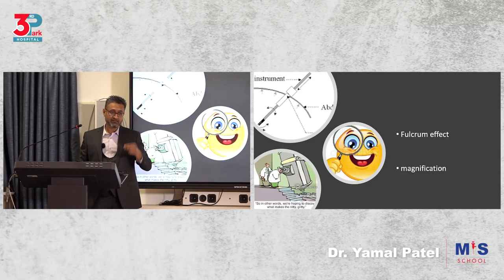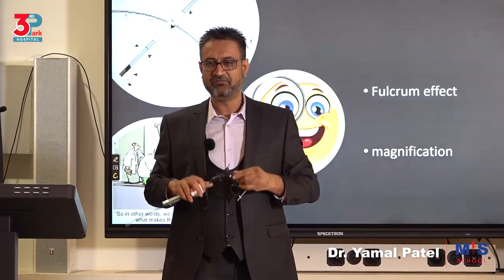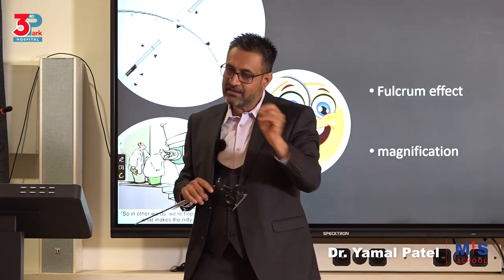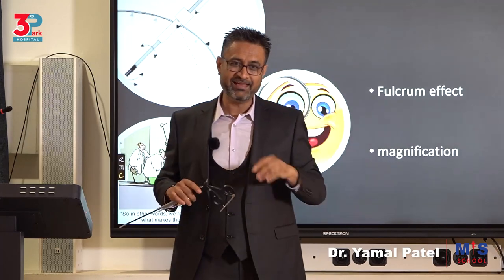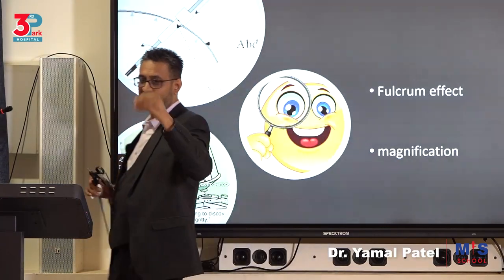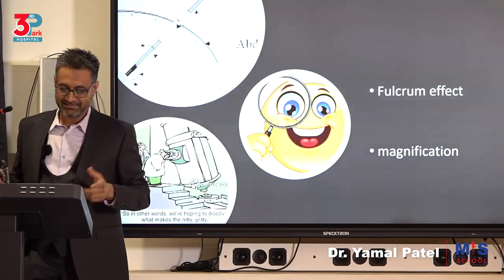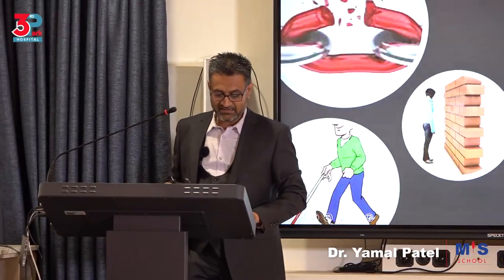Then magnification. You'll see even small capillaries sometimes when you're dissecting in very extreme cases, like in endometriosis where you're going very fine, you'll see up to capillaries. When you cut that, you'll have a little bleed, but that's going to be like a very small streak, but on a screen, it might look a bit obvious. So you have to learn that, listen, not every single RBC in there that you see should be worried about, but initially it will look like, oh, there's a bleeder.